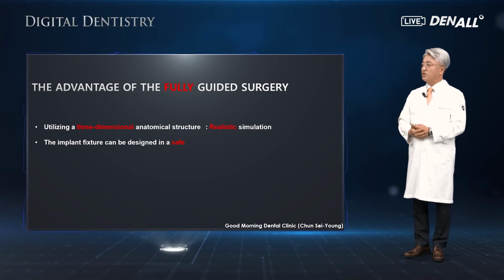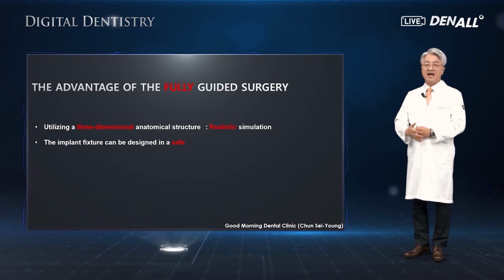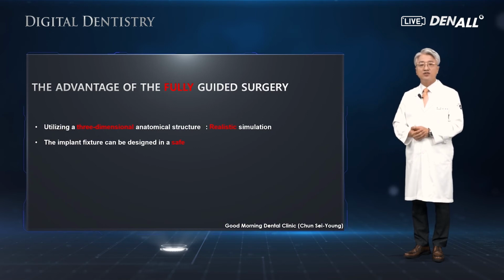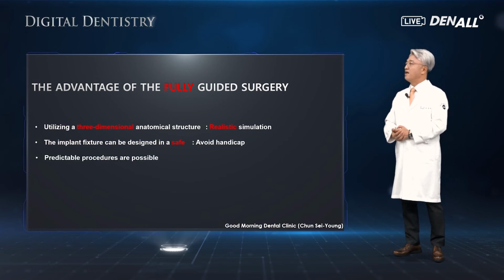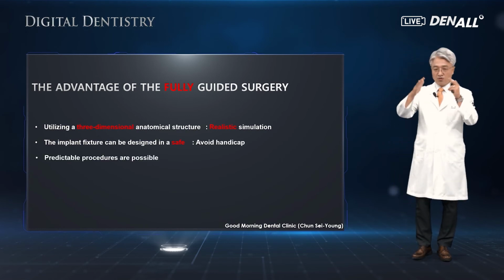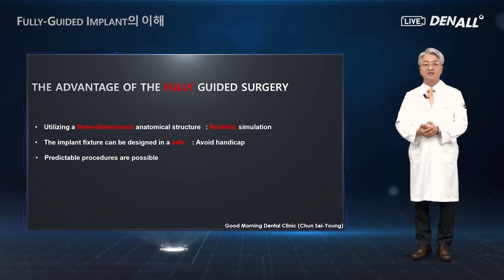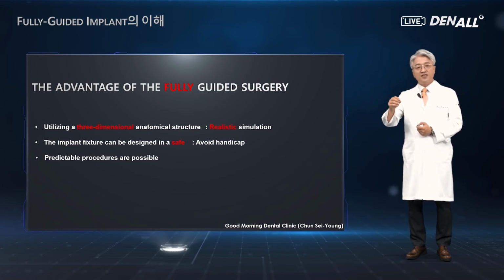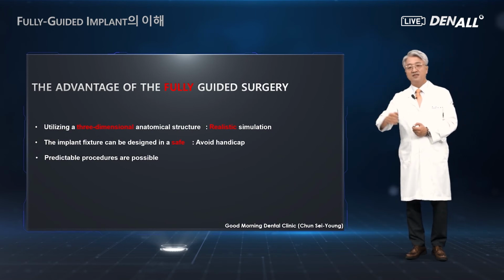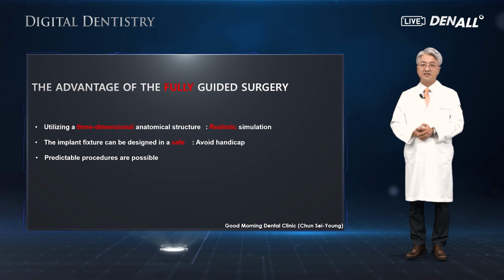The implant fixture can be designed in a safe place, in safe positions. And on the computer program, a three-dimensional simulation has been done to address predictable problems during surgery, and preparation can be done for such eventuality.